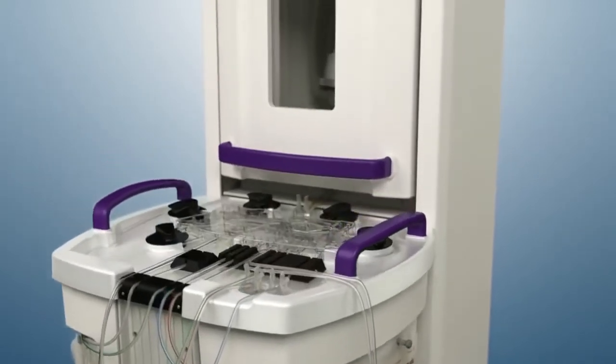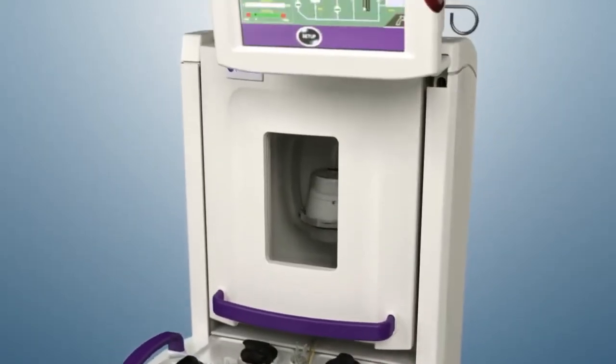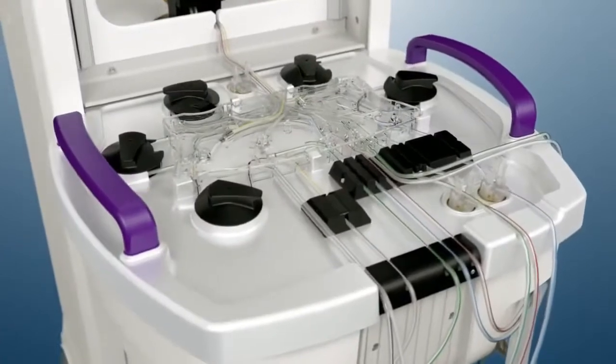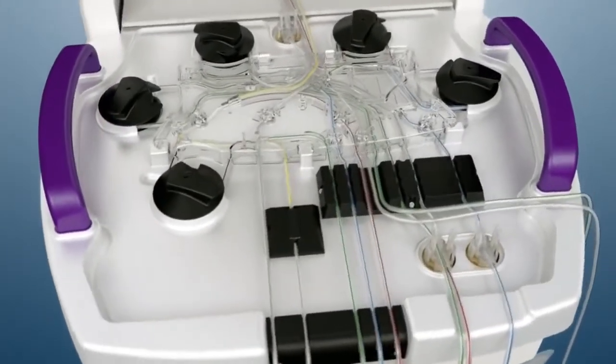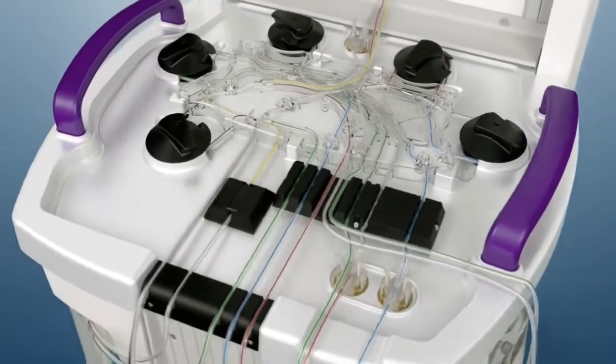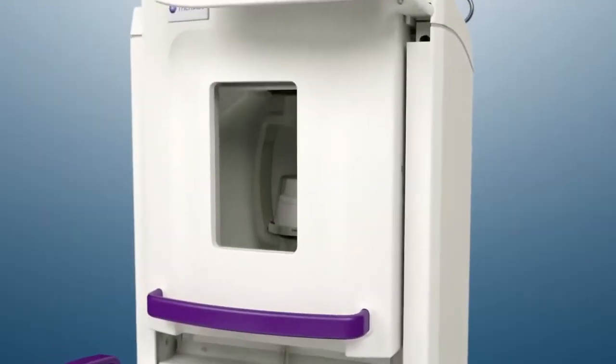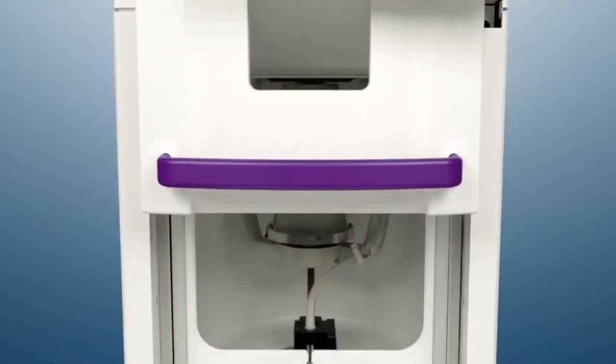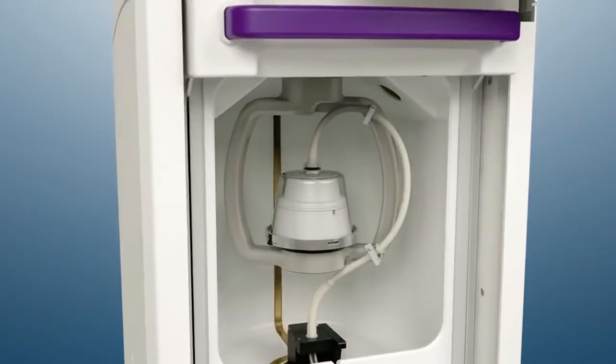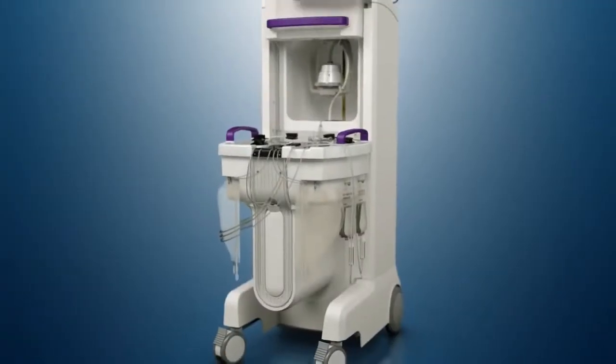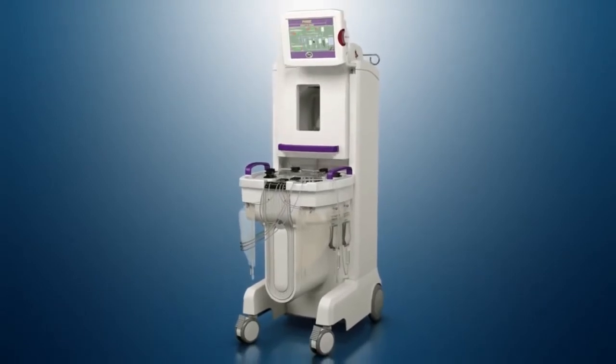Theracose photophoresis utilizes the Theracose Celex photophoresis system to combine cell separation and photo activation into a single integrated and sterile circuit. With advanced separation technology, reduced extracorporeal blood volume, and shorter treatment times, the Theracose Celex photophoresis system provides a new level of patient focused care.